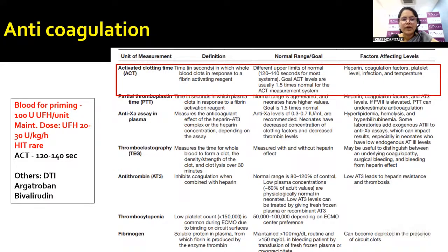For monitoring anticoagulation, one generally uses the activated clotting time in seconds, which is the time taken for whole blood to clot in response to a fibrin activating agent.